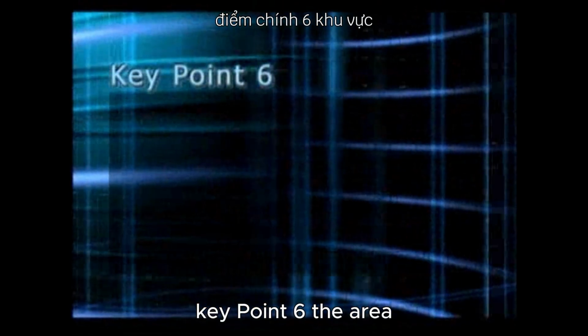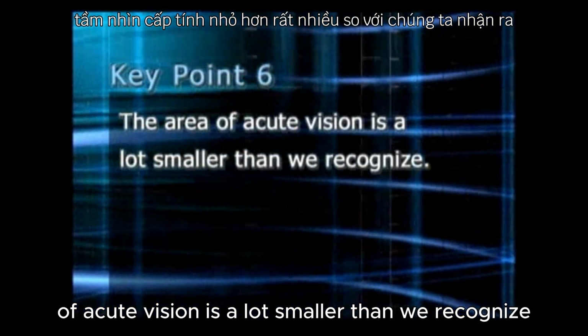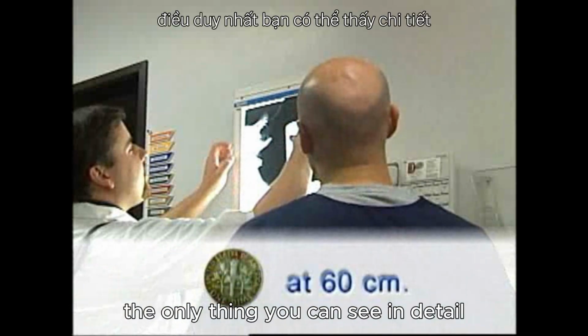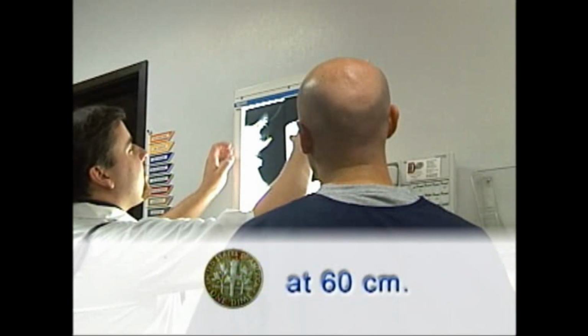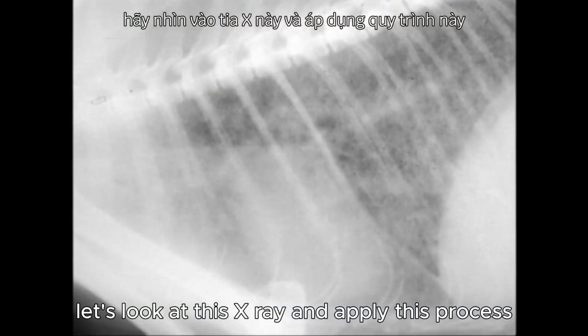Key point 6. The area of acute vision is a lot smaller than we recognize. Remember the dime. The dime strategy says the only thing you can see in detail is the size of a dime. So always have the dime in mind. Let's look at this X-ray and apply this process.